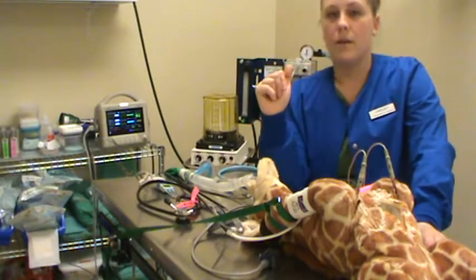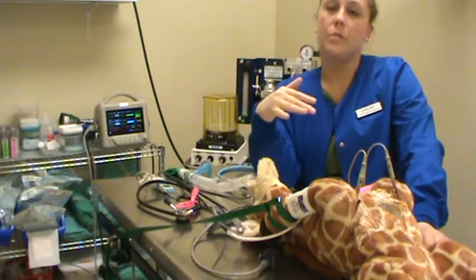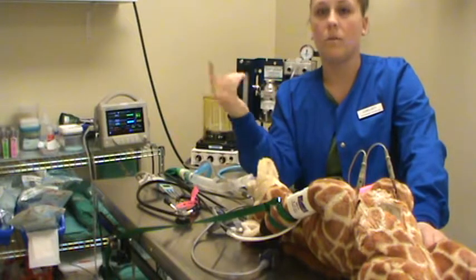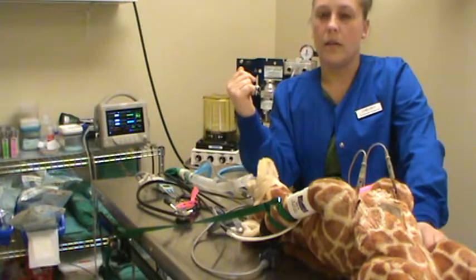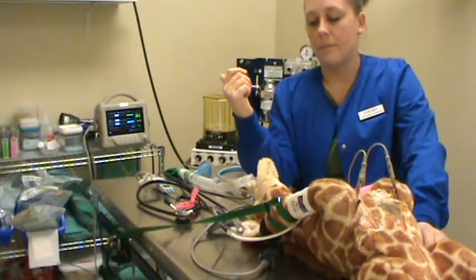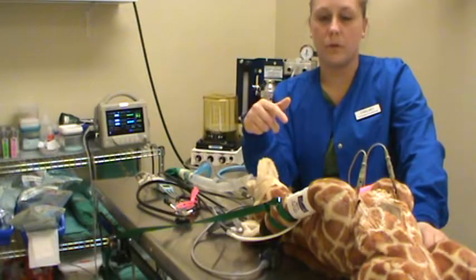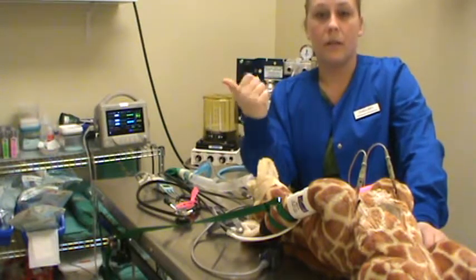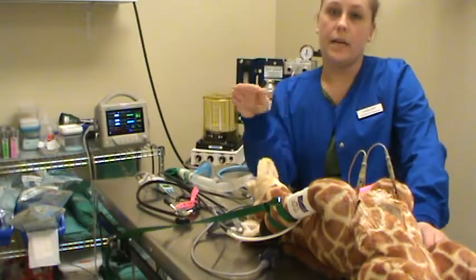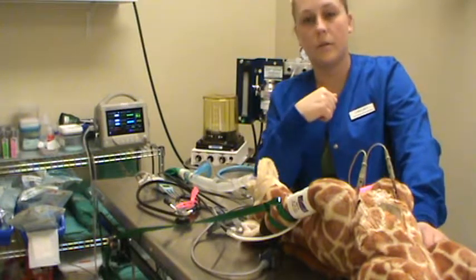Dogs, on the other hand, are a little different because they're small dogs and large dogs. So the smaller breeds are going to have a heart rate up to about 180, anywhere from 70 to 120, all the way up to 180. Little dogs are going to have a little more excitement, a little more anxious. They have a quicker heart rate. So it's not abnormal to see a 180 for a smaller dog. Your larger breeds like your Great Danes, your Shepherds, your large Pit Bulls, your Mastiffs are going to have a slower heart rate, even down to 65, 70, 80 during their anesthetic procedure.